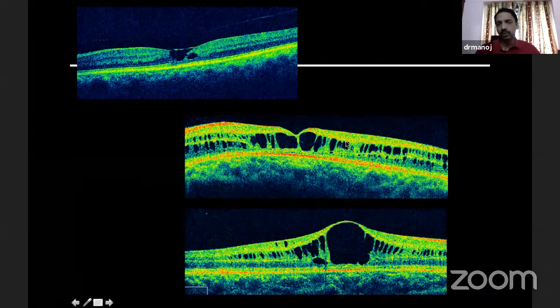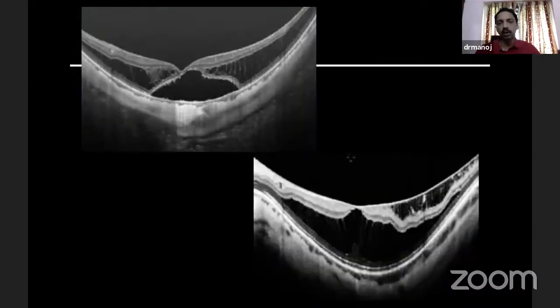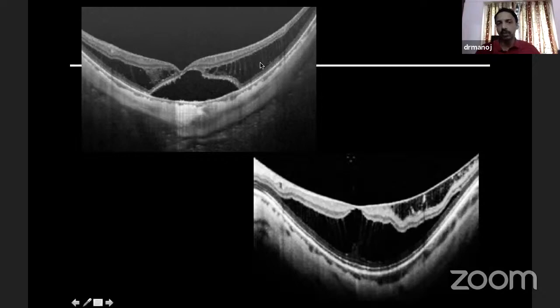Sometimes you see cysts which are extensive. These are patients with juvenile X-linked retinoschisis — retinoschisis can also appear like this. This is a differential diagnosis for cysts, and many of these conditions are bilateral. These are examples of baccular retinoschisis in myopic eyes — you can see these schitic cavities, and often you see septa that are very evident in these eyes.